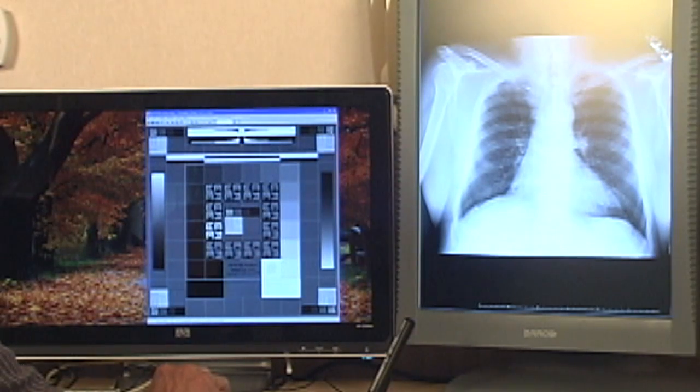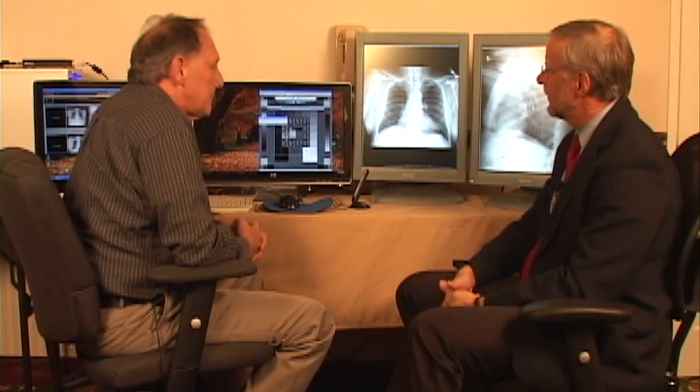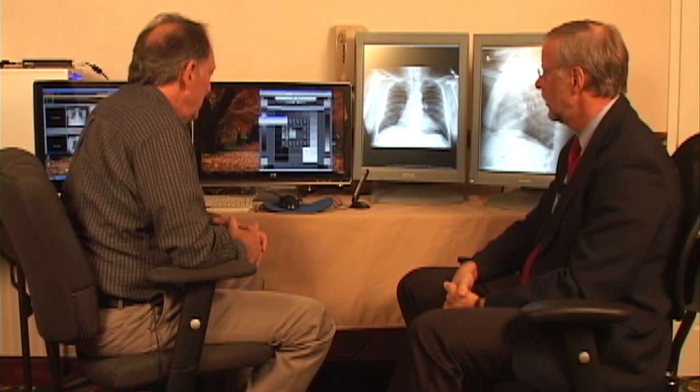Okay. So imagine we have this commercial grade monitor, we bought this light meter, and then what's involved in the calibrating? How hard is it to do? Can you show us a little bit how to build it out?